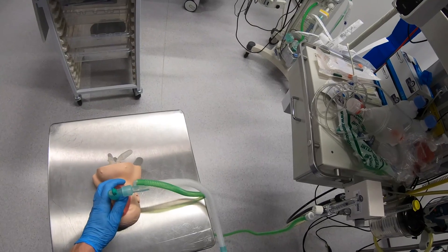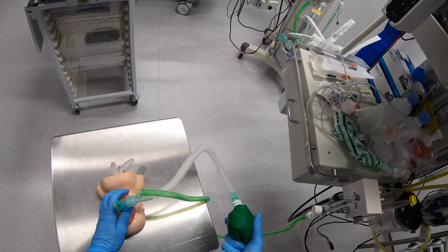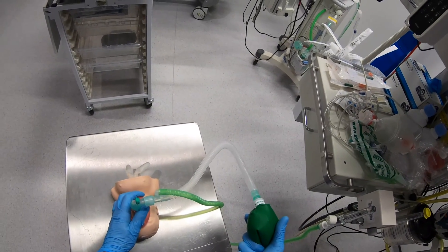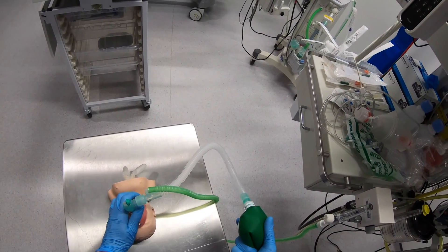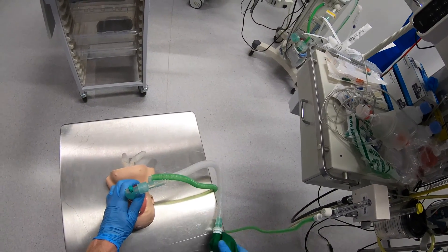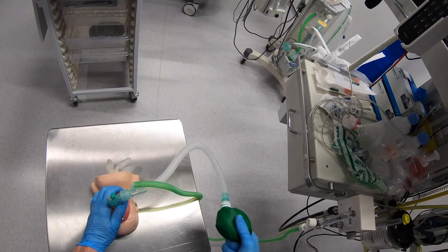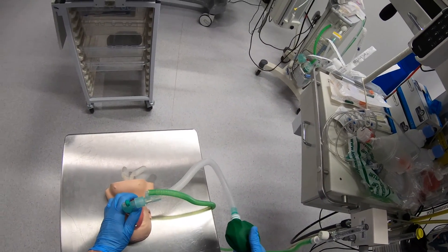I can deliver just PEEP or positive pressure ventilation. If I just squeeze off the bottom of this I'm delivering just PEEP to the patient. You'll notice my bag stays up in inflation, it doesn't collapse, and I'm transmitting the PEEP to the patient. The bag will then go up and down in my hand as the patient breathes.